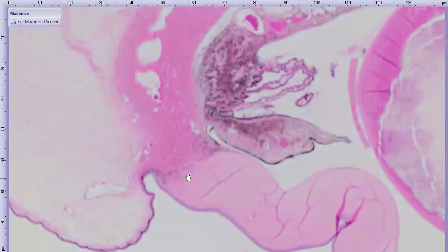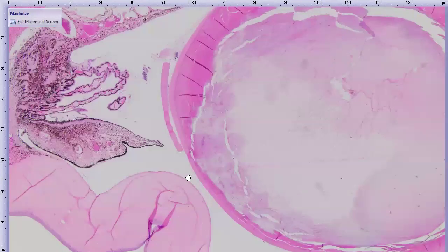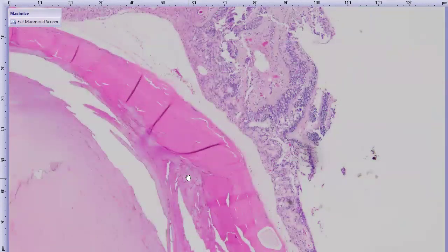But it was not causing glaucoma, although all of that aqueous humor could have been shunted out into the giant cyst as well. There's also a cataract. So there's some cataractous degeneration of the lens. We have posterior migration of the lens epithelium, and then some jumbling and disorganization of the lens fibers. So we have a cataract as well.